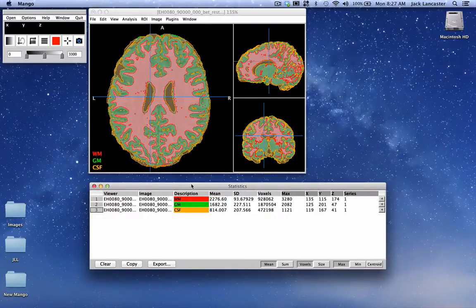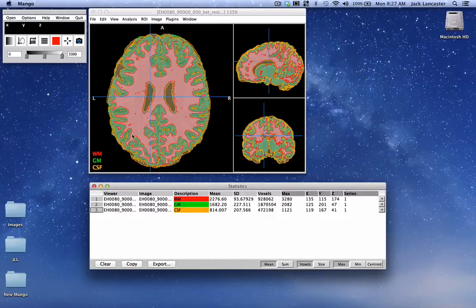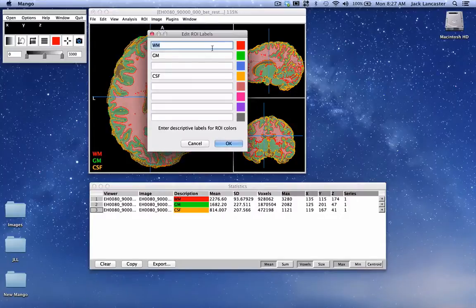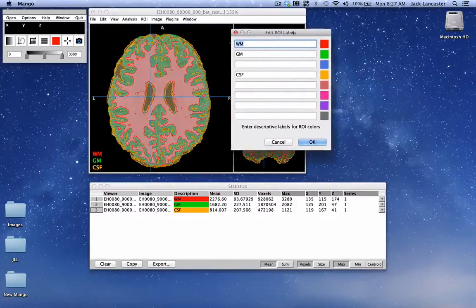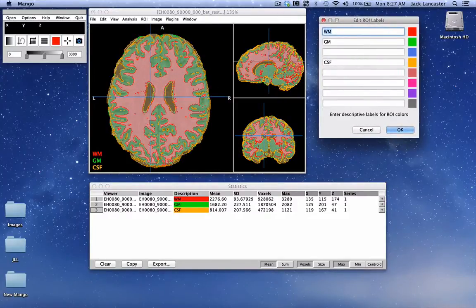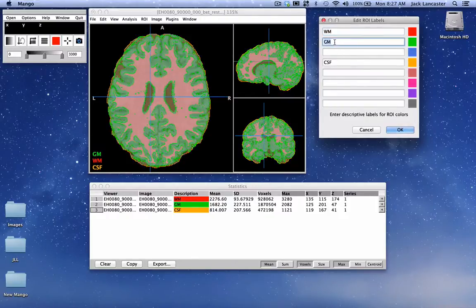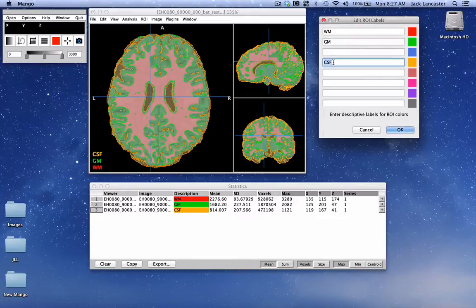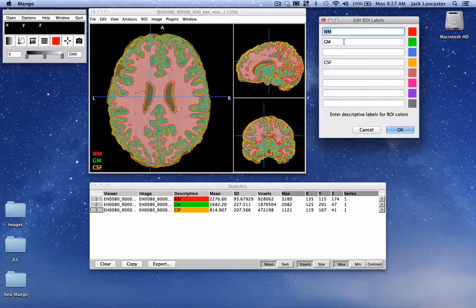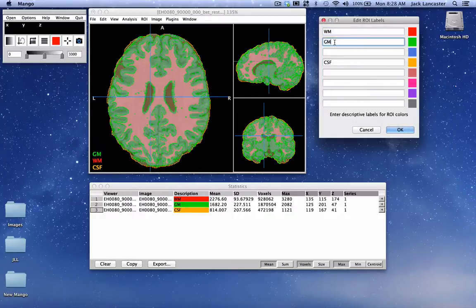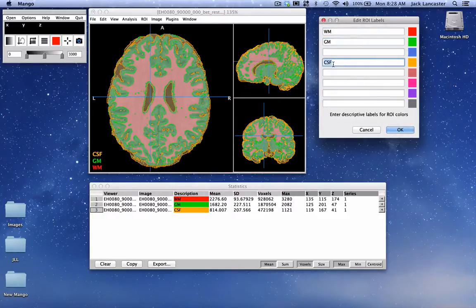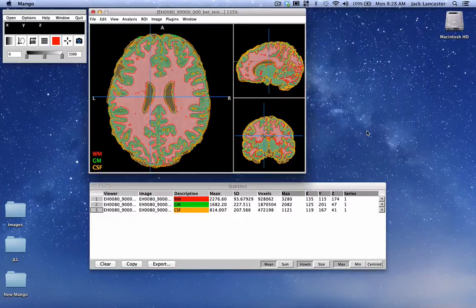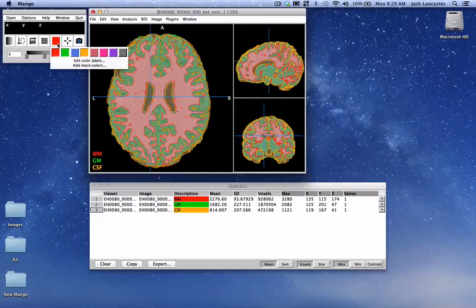In terms of the colors, let's go back over here to this palette. Notice we have two options under this palette to edit, edit the color labels. So I could enter them by pointing and clicking but I could have entered them here just as well. When you select it brings it to the top of the list. White matter to the top, gray matter to the top, CSF. Now we're bringing things to the top of the list based upon their label. So we won't use that right away but you might find that helpful in some studies.